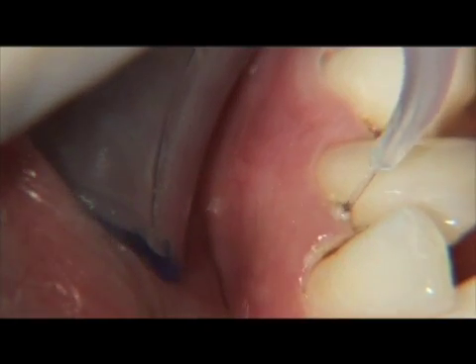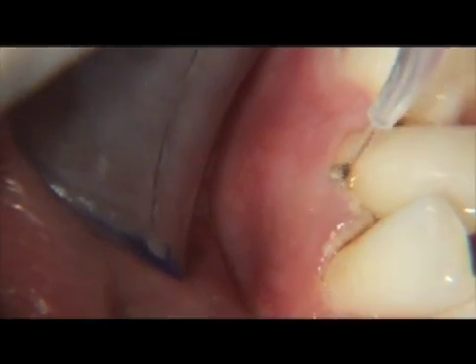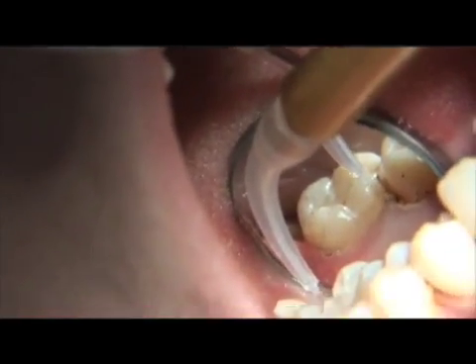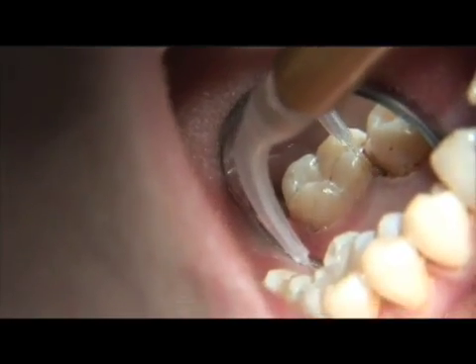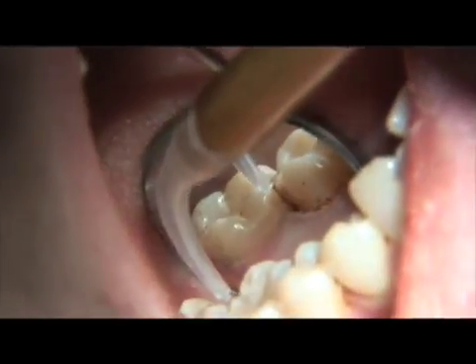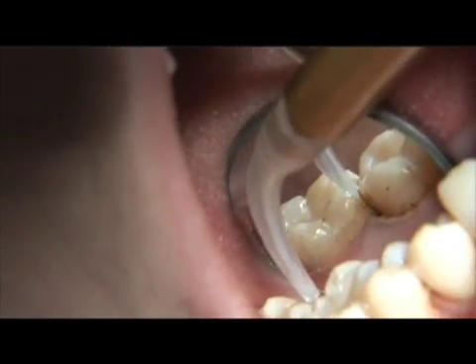Lower anterior teeth will take less time. Molars, especially with furcation involvement, will take more time. Laser curettage will take up to 10 minutes per quad of the periodontal therapy appointment, and 30 to 45 minutes if one is doing the entire mouth at one appointment.